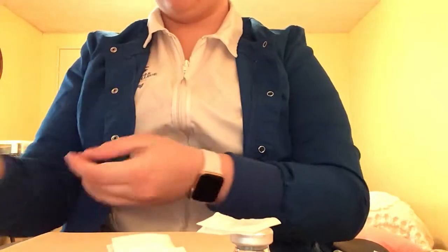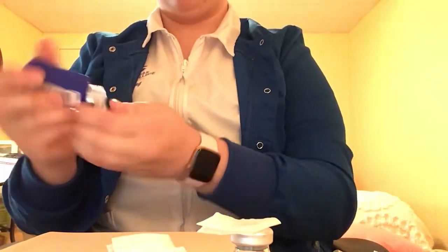And now I would go ahead and sanitize my hands one more time. For this one, I'm actually going to do it. And I would gather all of the rest of my supplies. So I am going to be using a 22 gauge 1-inch needle for my intramuscular injection.